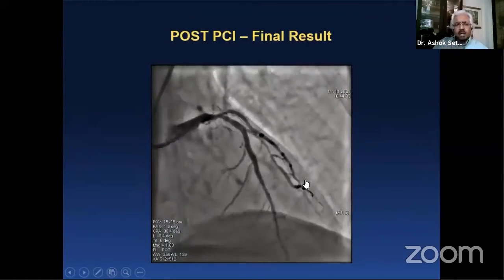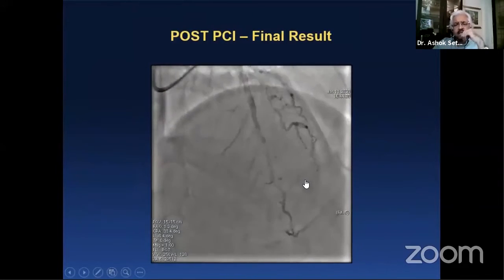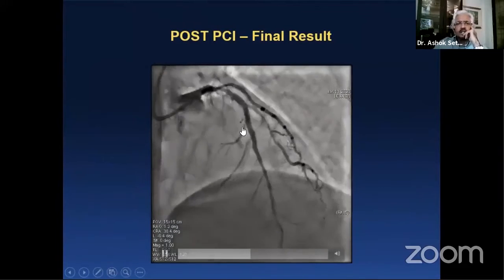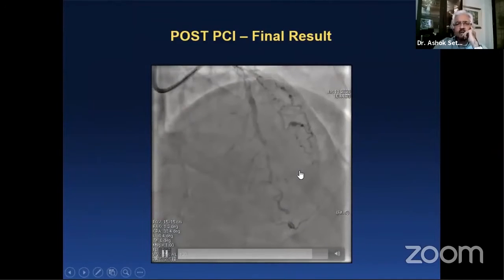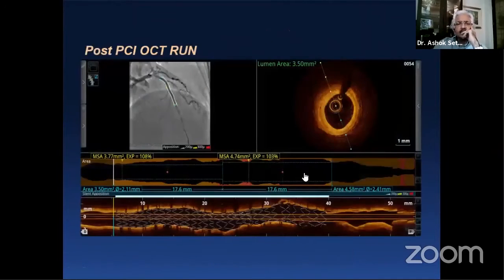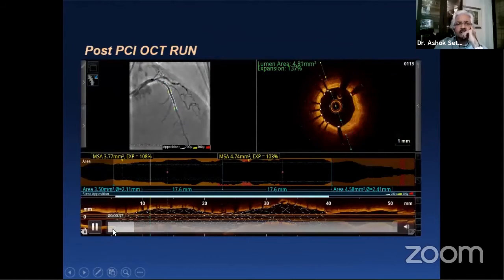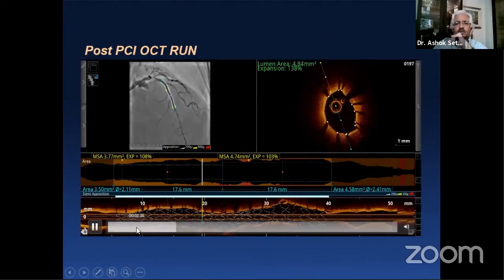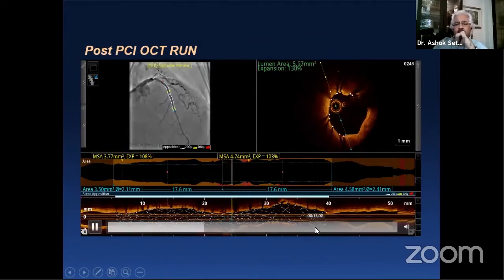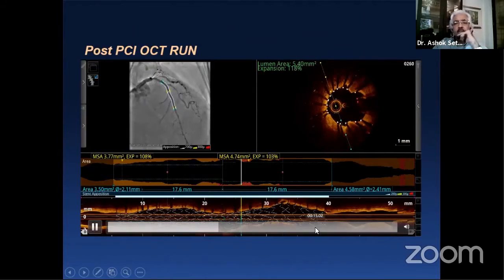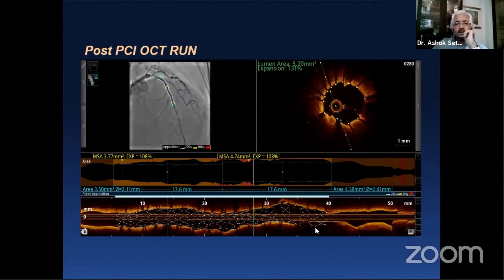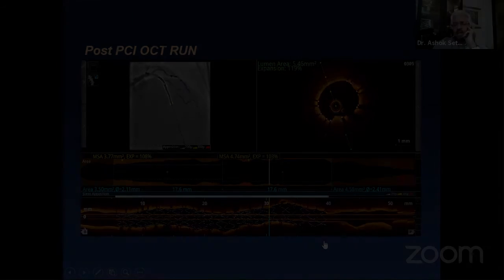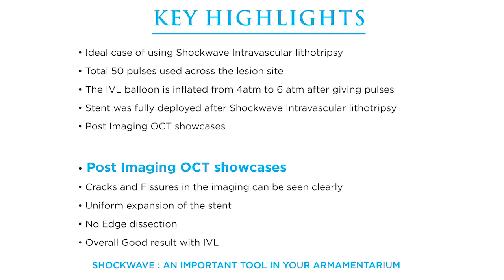That's what you keep doing across the length of the lesion. After stent implantation and dilatation to higher pressures under OCT guidance, you can see that the stent is very nicely and uniformly expanded, giving a large and uniform lumen right up to the ostium without any edge dissections.